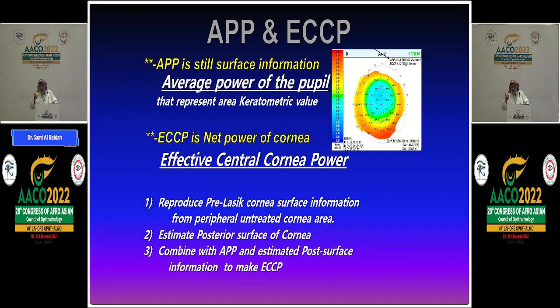And then it looks again to the 9 millimeters, to the posterior corneal surface. So it goes back, now it has the known posterior corneal surface as well as the new anterior one, and has the formula, they are added together and divided by 2.